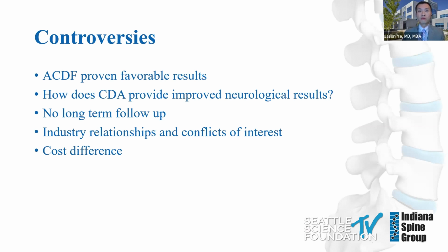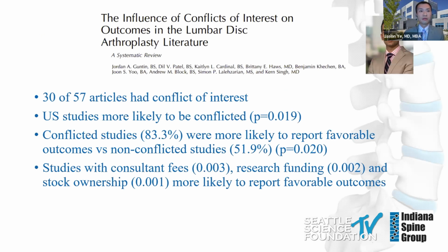Initially, there was no long-term follow-up available. It was uncertain if any favorable results shown in the studies would persist over time. There was also a concern that financial conflicts of interest would confound studies results with the IDE trials. Finally, cervical arthroplasty device was more expensive than ACDF. From the payer's perspective, any potential cost benefits from reducing reoperation at an adjacent level would occur far in the future, while they paid a higher price for the implant today.